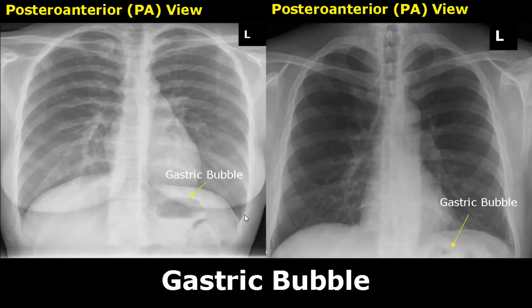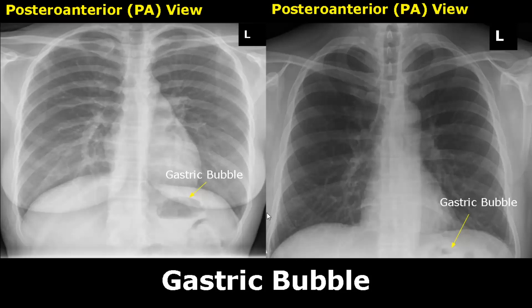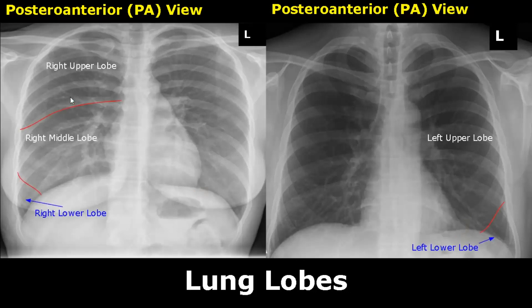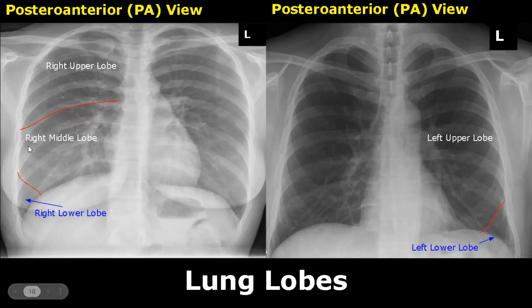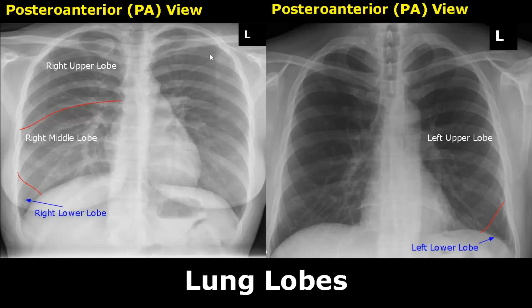The gastric bubble can also be seen on a chest x-ray. It is radiolucent due to the presence of gas in the stomach. The right lung consists of three lobes, whereas the left lung is divided into two lobes. The majority of the right lung is occupied by the upper and middle lobe, and only a small portion of the lower lobe is seen in the region above the right costophrenic angle. Similarly, only a small area above and around the left costophrenic angle is the left lower lobe, and the rest of the lung is the upper lobe.